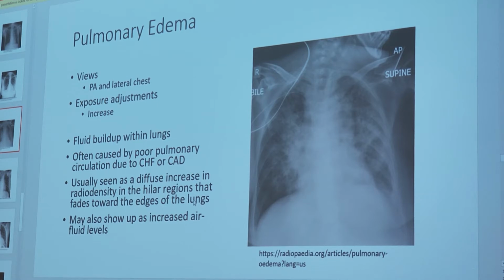For example, atelectasis versus pneumothorax, right? Both of them sort of involve the collapse of the lung. But which one will show you a pleural space filled with air? Pneumothorax, correct. So in the pneumothorax, you expect it to look dark. Right? On atelectasis, you don't have air in those spaces, so it looks more white.